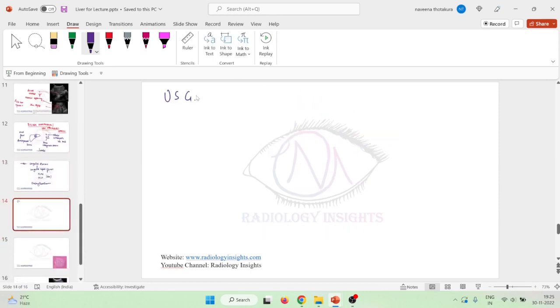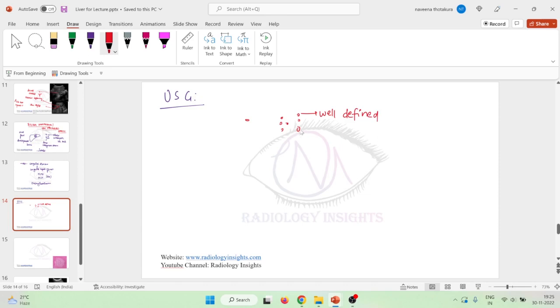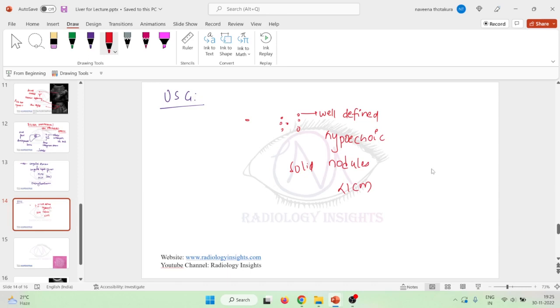If you see these biliary hamartomas on ultrasound, they are seen as single or sometimes multiple well-defined lesions. The wall can be clearly noted. They are hypoechoic and are seen as solid nodules less than one centimeter in diameter. Sometimes they may also be associated with bright echogenic foci.